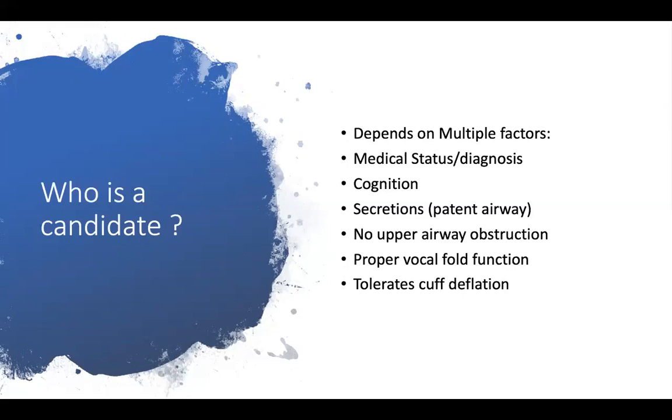So the point is, if the secretions are so much that they are blocking the patient's airway, then that patient is not a candidate for speaking valve fitting. But if it's not too thick or not blocking, it's there but it's not a lot, then that patient might be a candidate for speaking valve fitting.